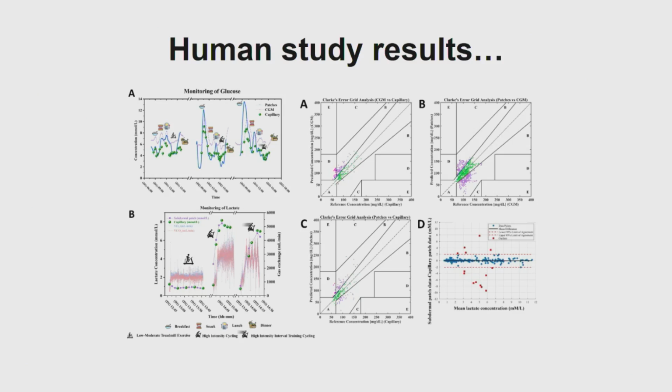And then these are the results that I already showed in the morning. These are day 1, day 2 and day 3 studies. The problem we have here, which I like in the animal studies and I don't like here, is these gaps that we have. This is because this is how the research ethics approvals, the Ministry of Defense ethics approvals were given. They did not want us to do any studies overnight, and that's why we had to basically stop measurement or stop recording during the night time. But anyway, the results look good with the AI thing.